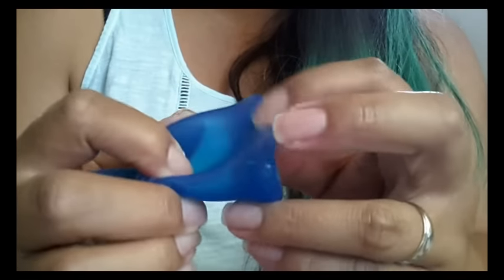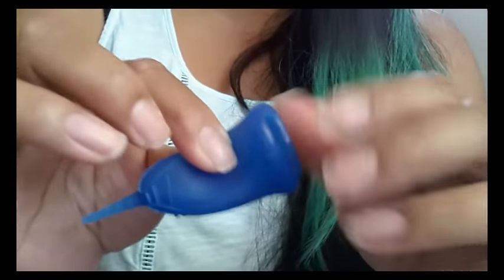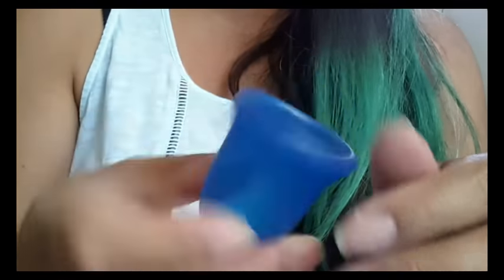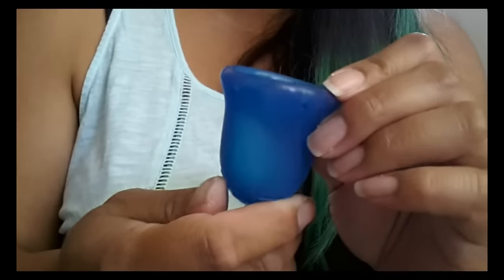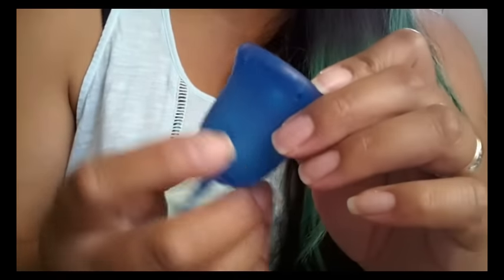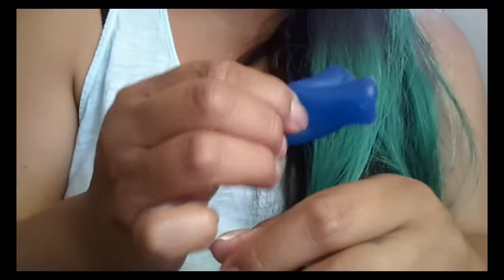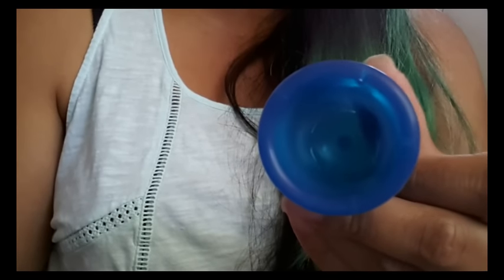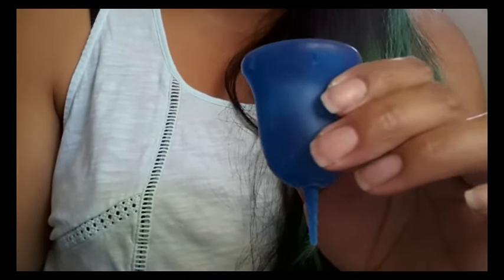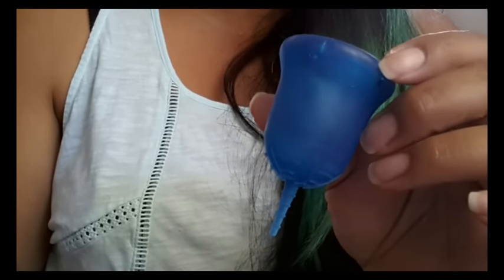If you have problems with it being too soft for your body to allow it to open all the way inside, only insert it halfway and then let it open and maneuver it into place. I really do like the Scoon and I'm glad I picked it up. It has become one of my favorites — maybe not my top favorite, just because I have to mind where I'm inserting it and letting it open. I'd rather just insert the whole cup and let it pop open. But I felt like this was a really nice, comfortable cup and I do recommend it. They have two different sizes, so make sure you choose the size that's right for you and read all that information on their website.